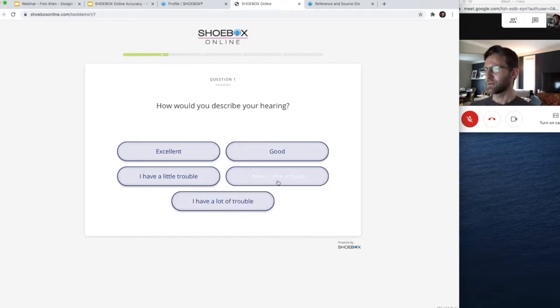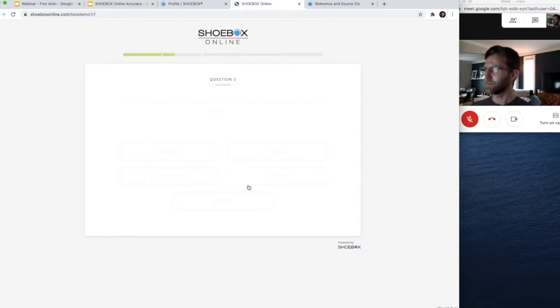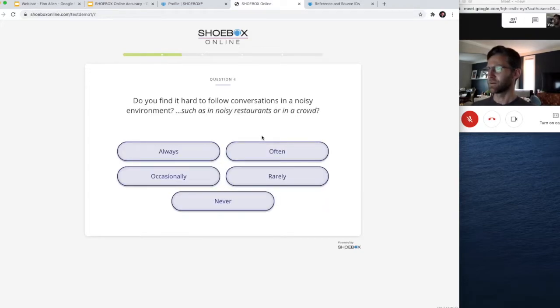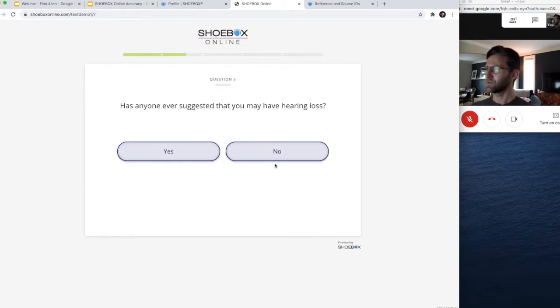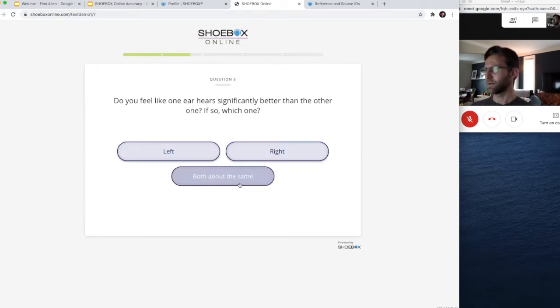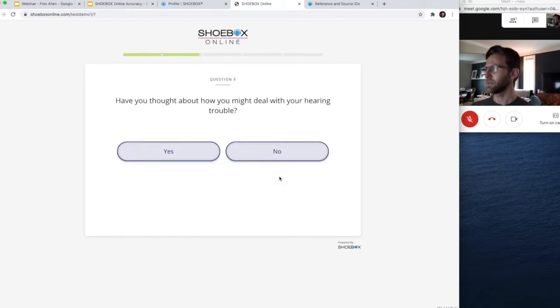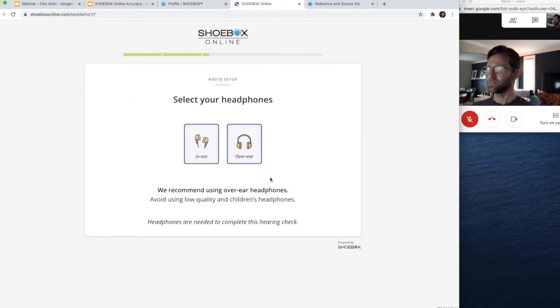So I'm going to say I have some trouble in conversations in quiet environments. Yeah, occasionally people mumble. Do I find it hard to have conversations on the phone? Pretty good. Do you find it hard to follow conversations in noisy environments? Yes, occasionally. Has anyone suggested you may have hearing loss? No, not yet. Do you feel like one ear is significantly better than the other? They're both about the same. Who do you have the most trouble hearing? I don't think I have any difficulty. Have you thought about how you might deal with these troubles? Not at the moment. And I don't know.